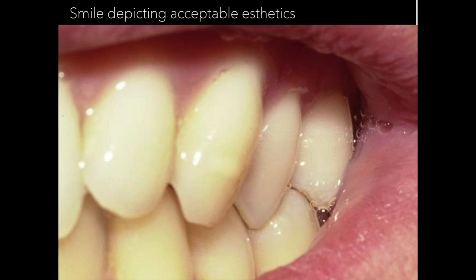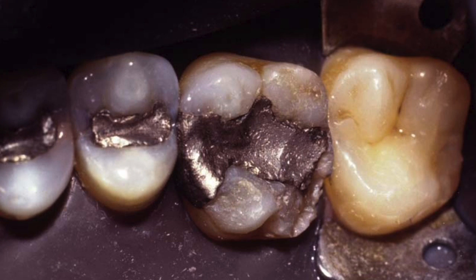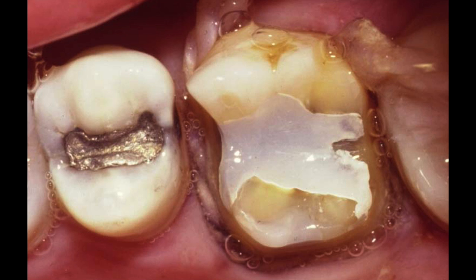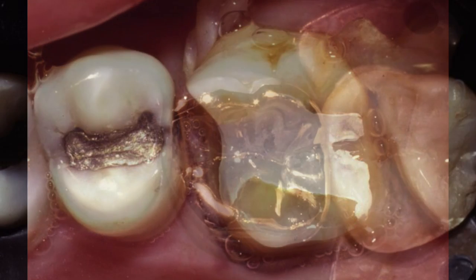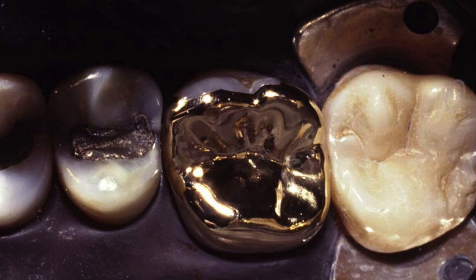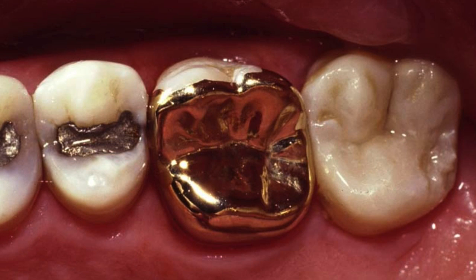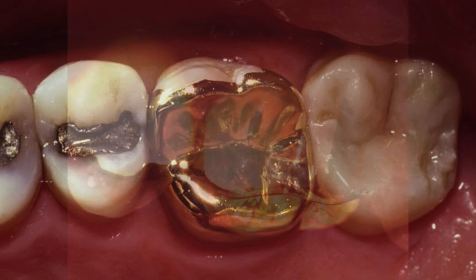This particular patient had a second molar — it never showed when he smiled. This is a modified seven-eighths crown, something I learned from Dr. Richard V. Tucker. Same procedure: clean it out, build up — this time with composite. You'll notice this one doesn't really have grooves; it's a little different, but equally satisfactory, providing the patient with a long-term restoration.